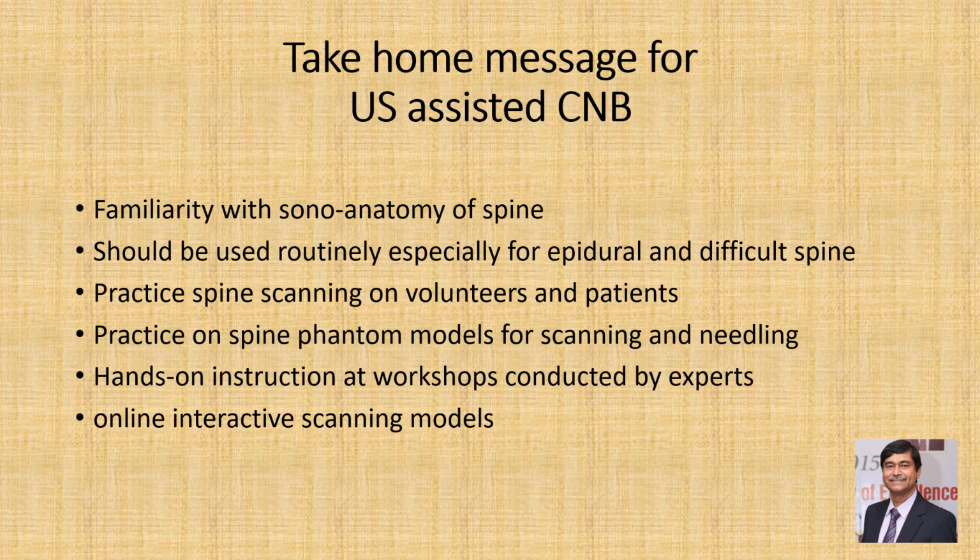So the take-home message is that we all should be familiar with the sonoanatomy of the spine. We should use it routinely for epidurals and difficult spines. We can practice scanning on volunteers and patients. We can practice on phantoms. We can attend workshops for hands-on training. And we can also attend online interactive scanning models. Thank you for your attention.